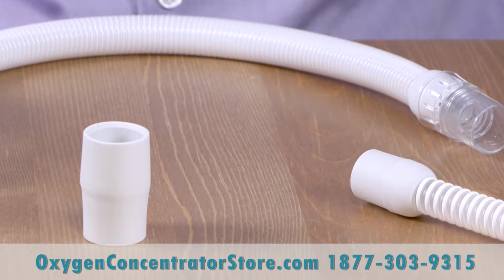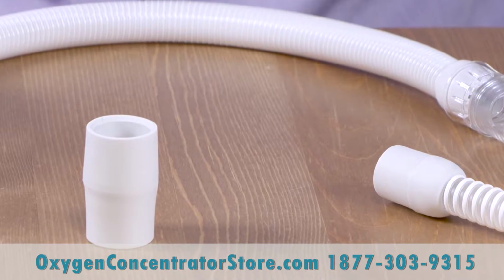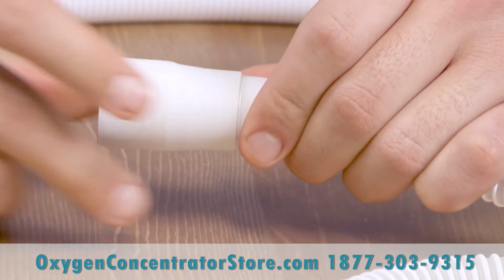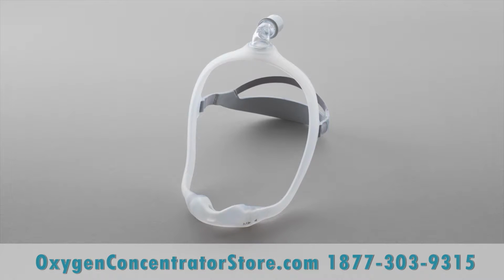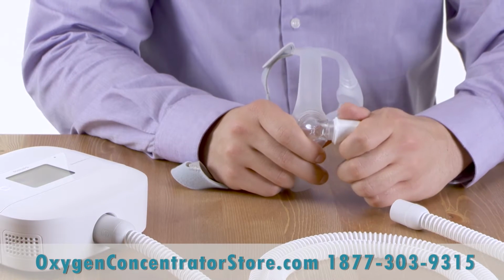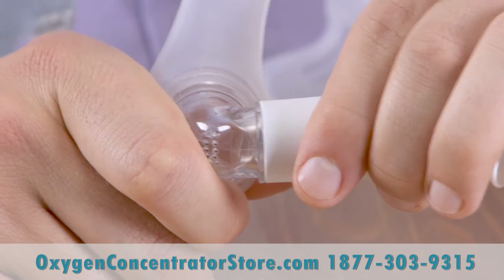For most masks, the 12mm tubing will require the adapter that was supplied with the tube. Simply slide the adapter onto the mask side cuff of the tubing and attach it to the mask. If using the DreamWear mask, you can take advantage of the minimal mask connection. Remove the white swivel from the DreamWear mask and click the 12mm tubing cuff into place.